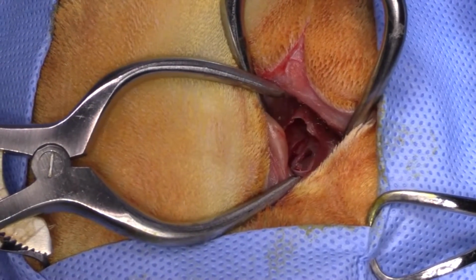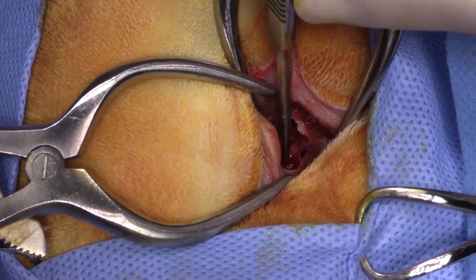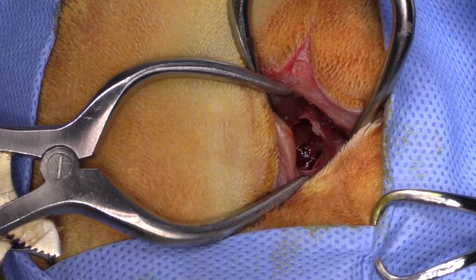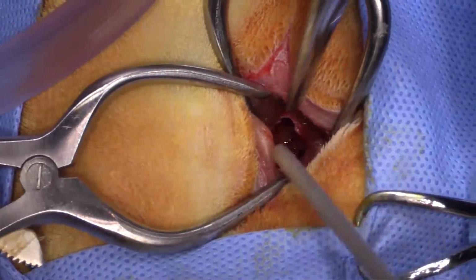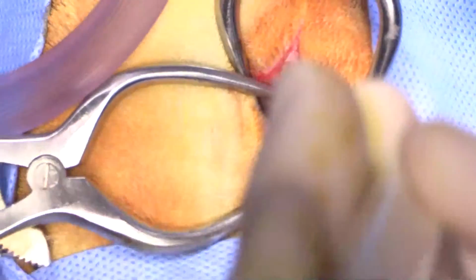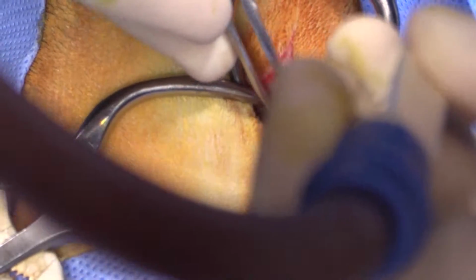I'll try to get some of that out with, let's see, what will I use? Just a curette. And then I'll get a hemostat and see if I can pull that out. It's not as critical as it is with a total ear canal ablation to get all that secretory material out, because with a total ear canal ablation you're not retaining the external ear canal, and so there's no place for the drainage to get out. Whereas with a ventral bulla osteotomy, we are maintaining the external ear canal, and so there's always an exit for any secretions that develop later on.